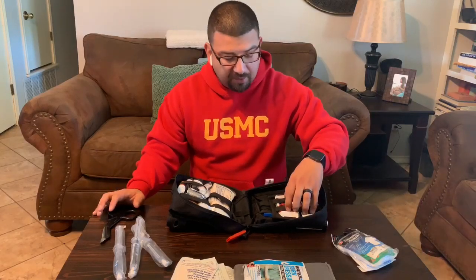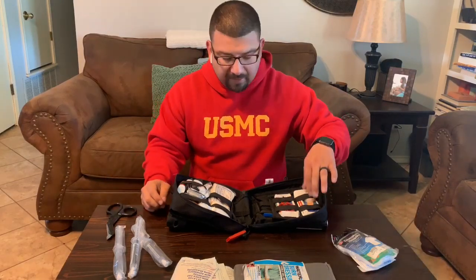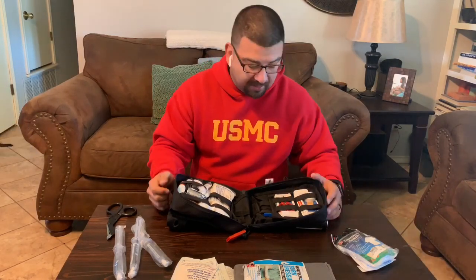I've had to use these before. A little kid scraped his knee, so I didn't want to come at him with these big old scissors, and he's kind of freaking out. So put a little piece of gauze on there, put a little piece of tape, and then I just use these little scissors to cut that tape.